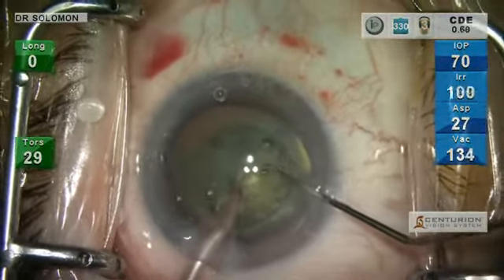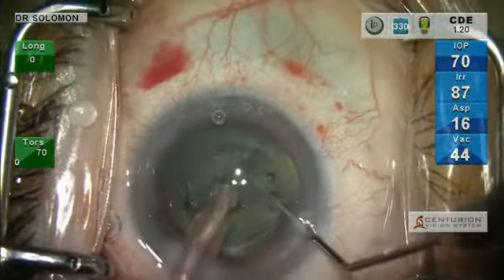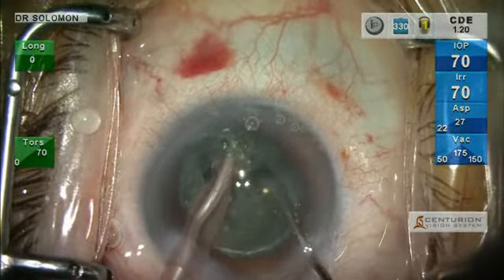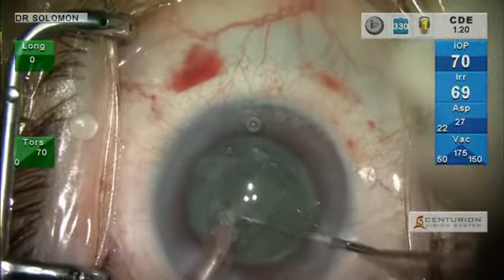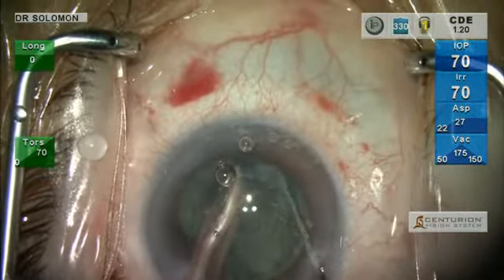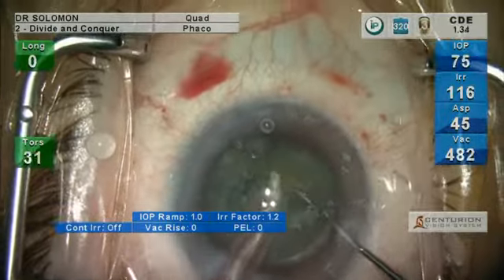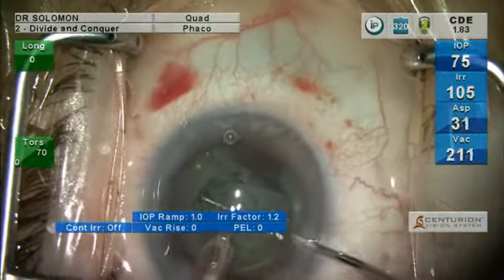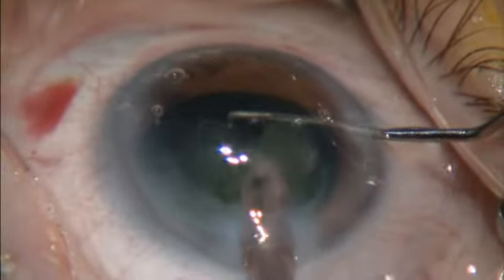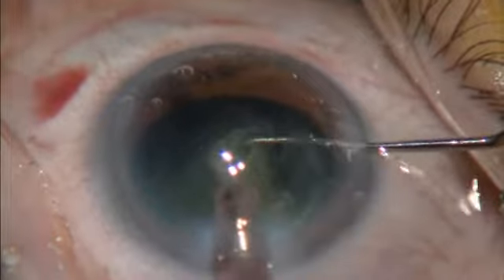We're going to create a little bit of a central trough and do sort of a stop and chop. I can really do my chop anywhere — I'm just propagating a crack or chop to the periphery along the lines of the matrix that's already been pre-divided. Now we can go to quad. Look how quickly the lens material dissolves at the tip — the material stays right at the tip and just dissolves right down the lumen of this balanced tip.